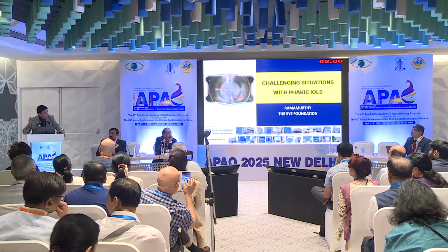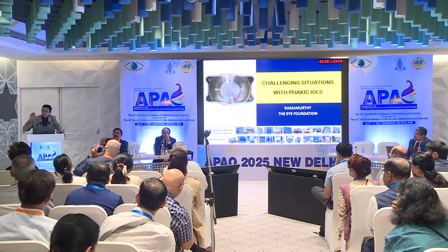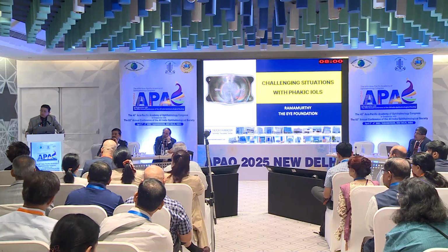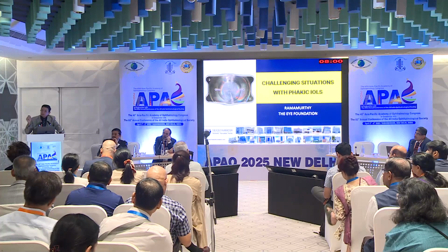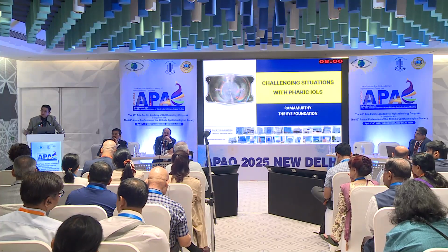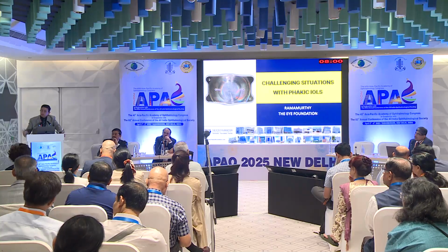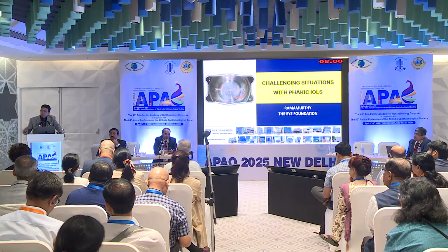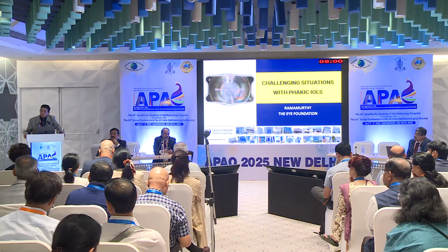I think that's an important question, where people go very wrong. Basically, you have to anesthetize the cornea and take it under an operating microscope. The limbus itself is a zone. So you take from mid-limbus to mid-limbus, where there's a merger of the white and the gray areas, and then compare it with a measurement from a topolyzer or an OPD-Scan, which will also corroborate it. If in both eyes it's nearly the same, it'll work well.